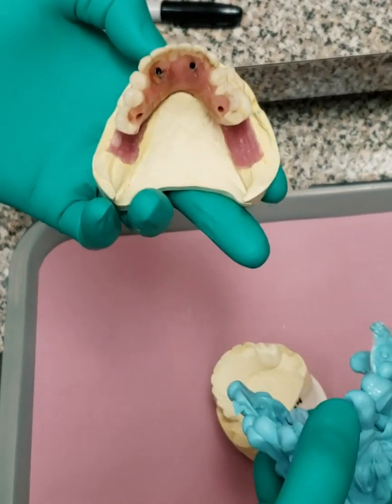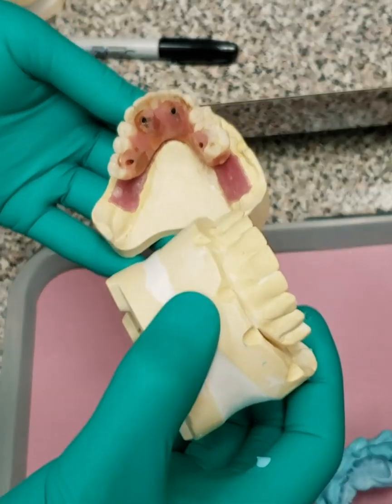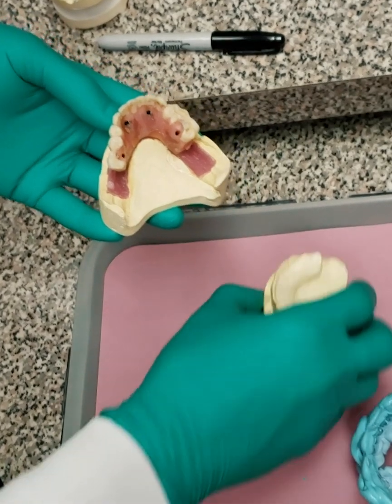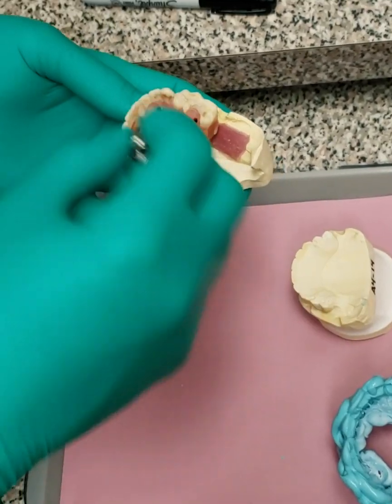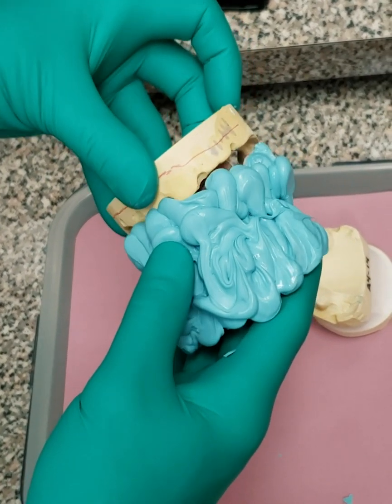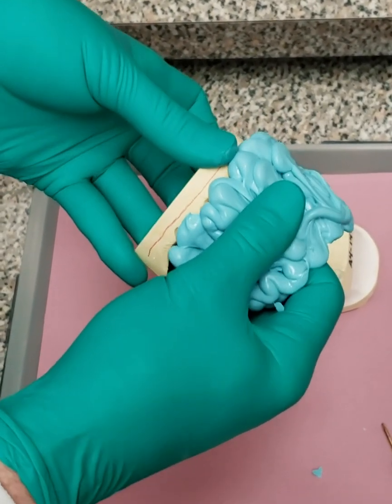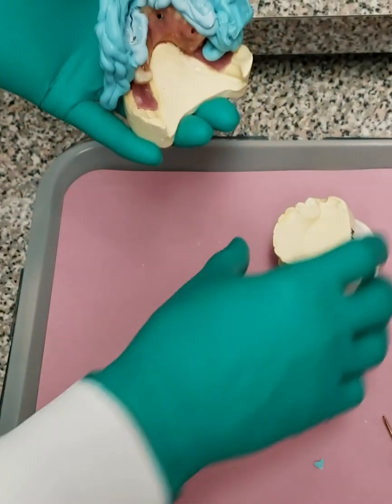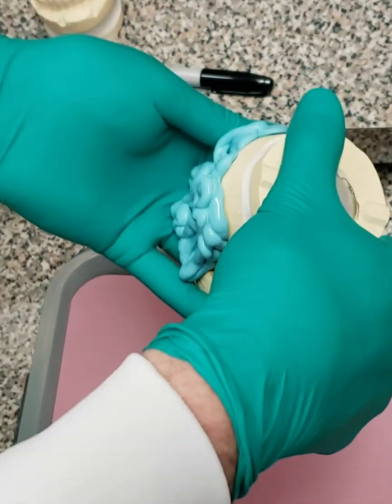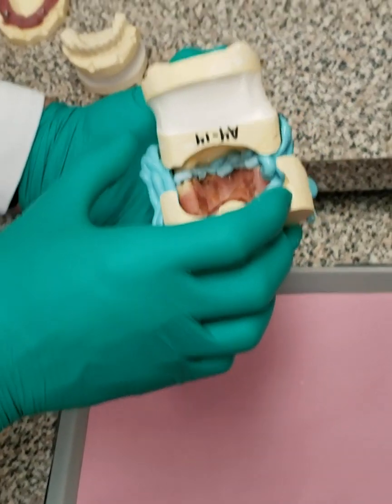Away. And if this were single, then you'd be finished. What this allows is to have the upper study model mounted to the lower working model. Now, what you can see if you take this off is the relationship. This will go exactly on here. You'll see that it fits exactly back down, and then you can see that the upper also fits exactly into this, and that's what the lab uses to mount the upper and lower vertical.